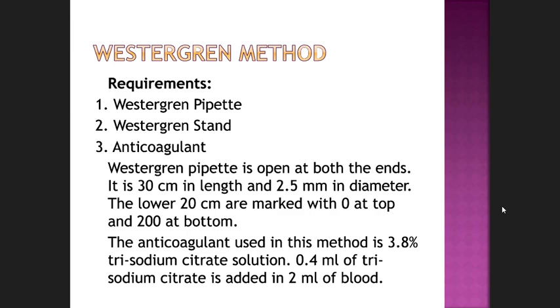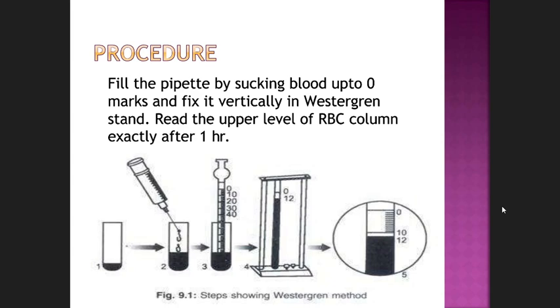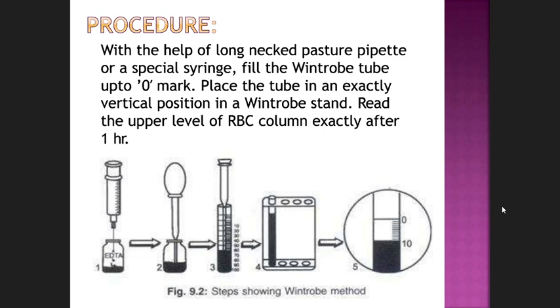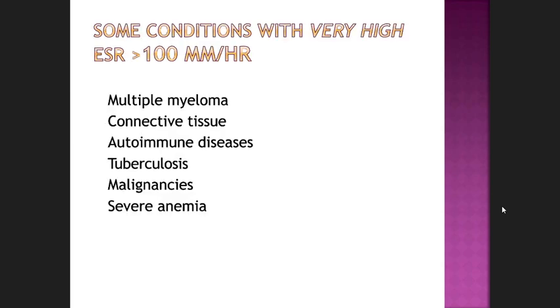Bhavya was there, no? So it's okay. You can study this as a theoretical thing. Procedure Bhavya has already told, and the requirements of Wintrobe and Westergren are a little bit different. So it's just a theoretical thing. You can just proceed. We've already done that.